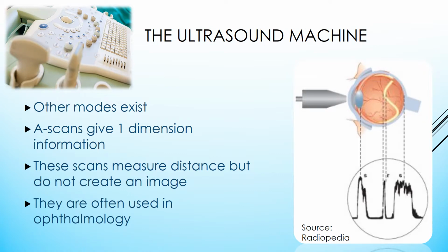Other modes exist. A scans give one-dimension information. These scans measure distance but do not create an image. They are often used in ophthalmology. A stands for amplitude.